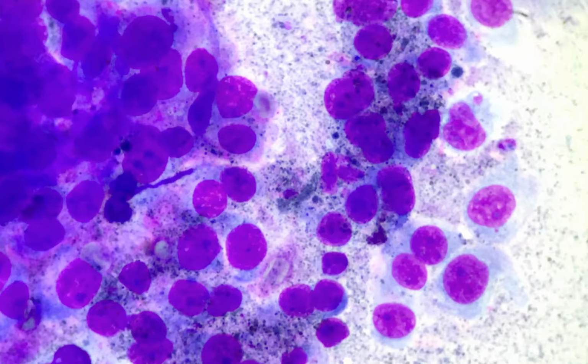So today I have a cytology that is taken from a cutaneous tumor from a 7-year-old Rottweiler, and the location of the tumor was in the right forelimb area towards the distal extremity. The tumor was subcutaneous and it was darker in color, so they were suspecting it could be melanoma. So cytologically also it looks a lot like melanoma.